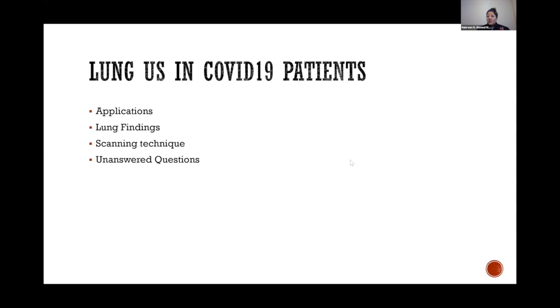So as far as the acute myocarditis portion, that typically, I shouldn't say typically since these patients are so incredibly atypical and unpredictable sometimes, but we are often seeing it towards the end of their clinical course. However, some patients are just coming in with chest pain and acute myocarditis. You might see pleural effusion. You might see regional wall motion abnormalities. You might see biventricular failure.